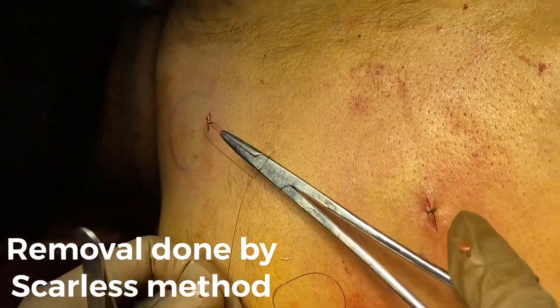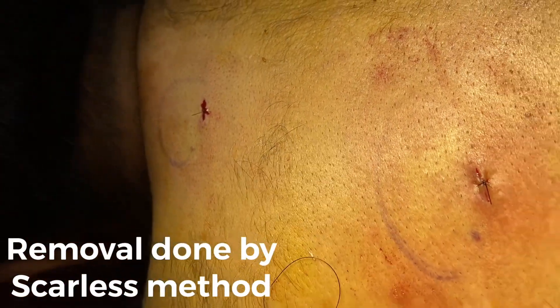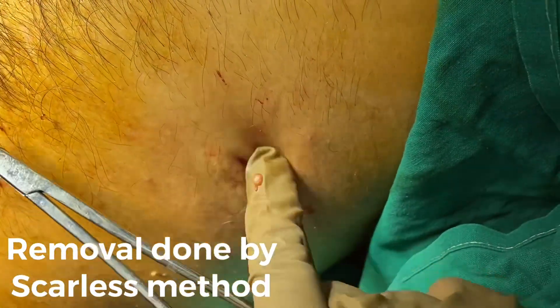Now, this one. Multiple lipomas were there. These are small, small incisions we have taken. These are big, big lipomas.